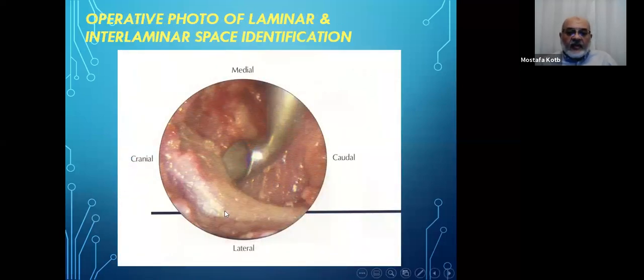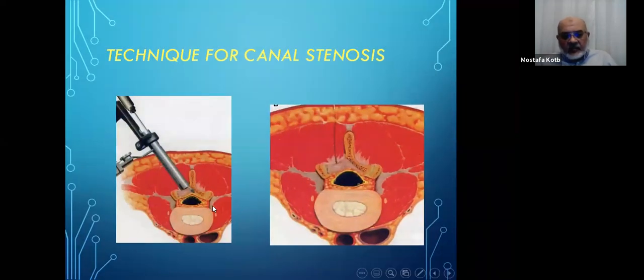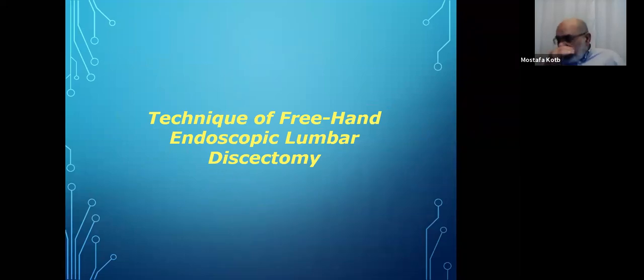This is the view you see from the working tube when you have the lamina, this is the joint, the ligamentum flavum. You start by separating the ligamentum flavum from the lamina, and you take out the part of the lamina with the Kerrison, same as you do in any sort of microscopy. And by tilting the tube, you can reach and take out bone to do some posterior decompression of the spinal canal in cases of canal stenosis. I went on working with this technique, both the Endospine and the sequential dilators techniques, for a few years, but I was not totally satisfied with it.